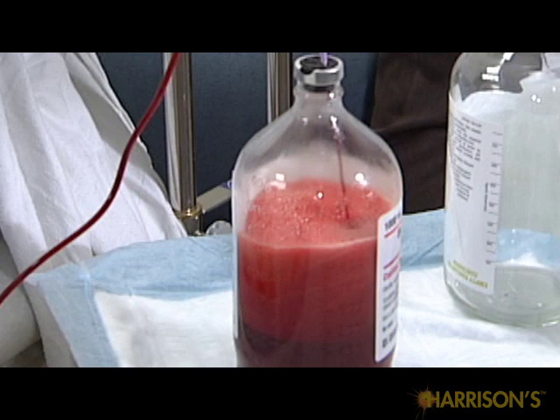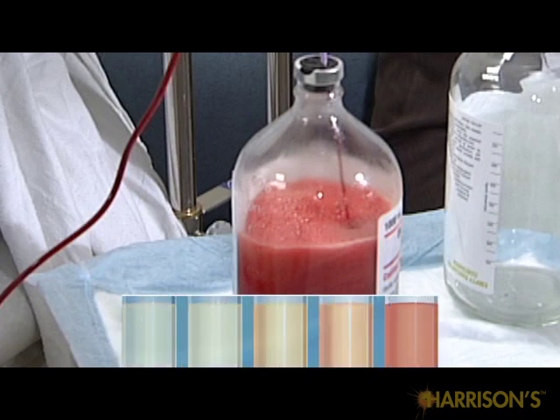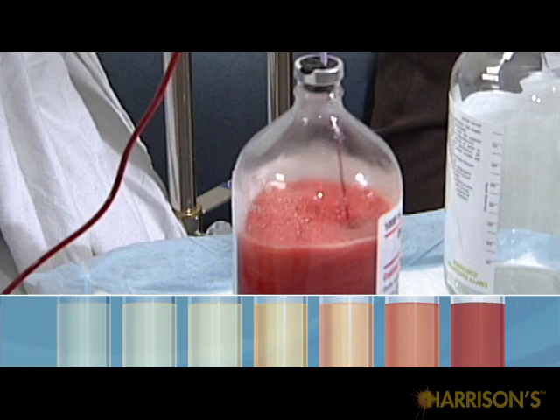Most pleural effusions are straw-colored. However, the color may vary from nearly clear to hemorrhagic. In the case of an unexpected finding of hemorrhagic effusion, ensure that the pleural space was properly entered and that the fluid does not represent procedure-related blood vessel injury.